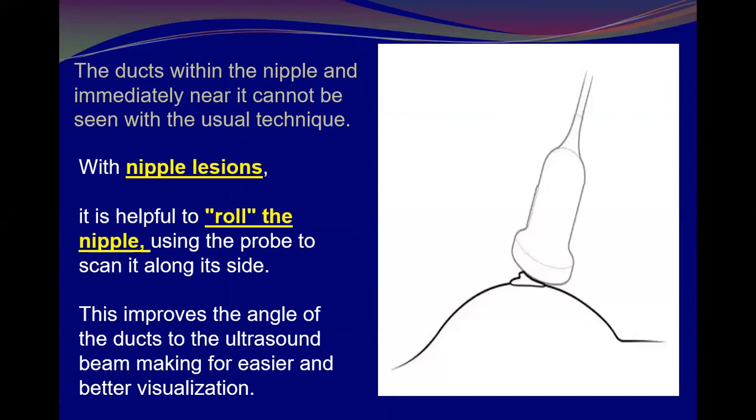But we can also use other techniques to evaluate the nipple area, especially to visualize the duct, by rolling the nipple, using the transducer itself to roll the nipple.